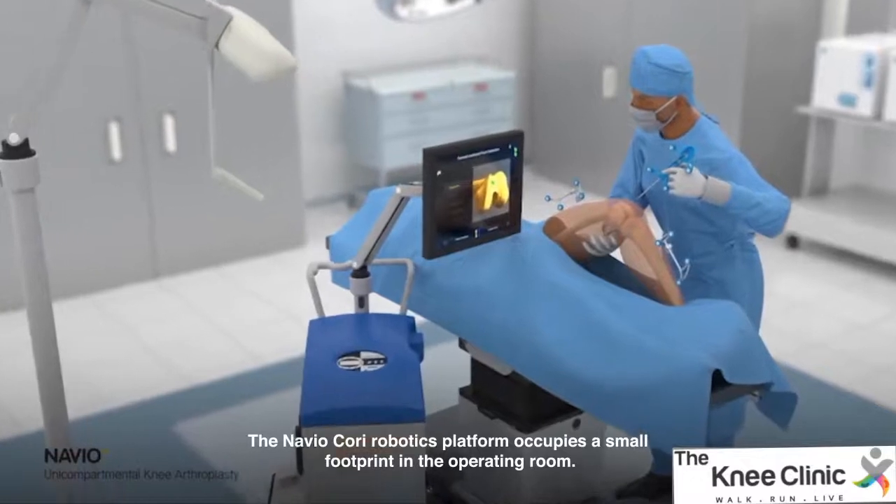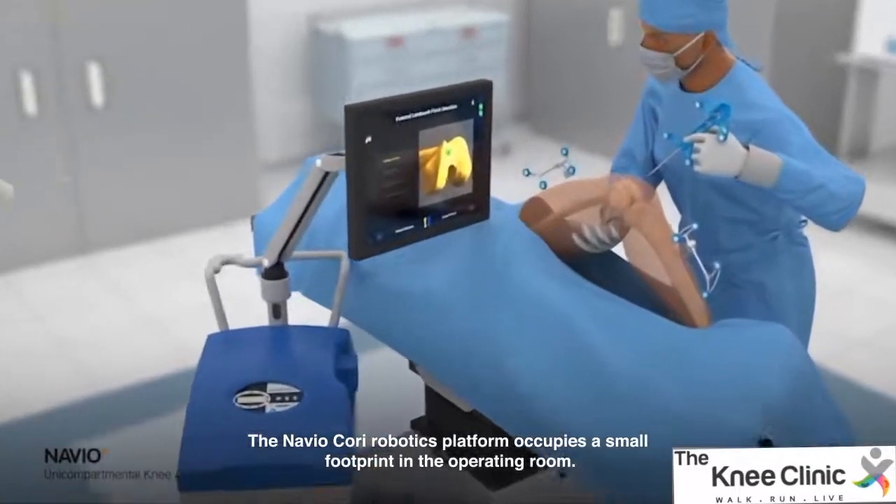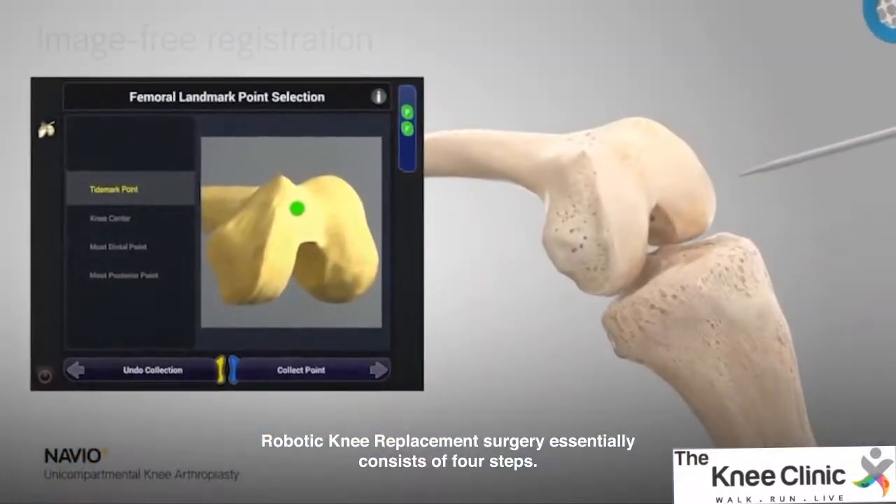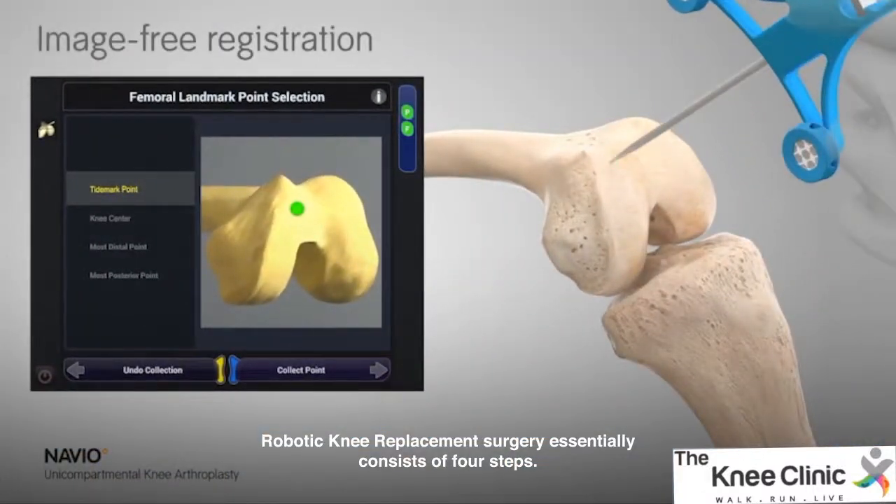The Navio Kori Robotics Platform occupies a small footprint in the OR. It is stationed opposite the surgeon. Robotic knee replacement surgery essentially consists of four steps.